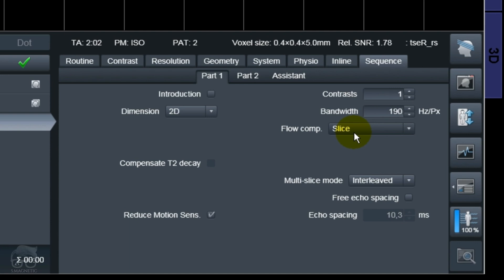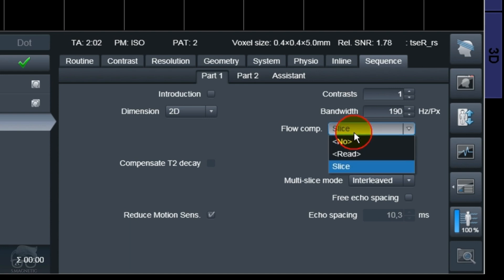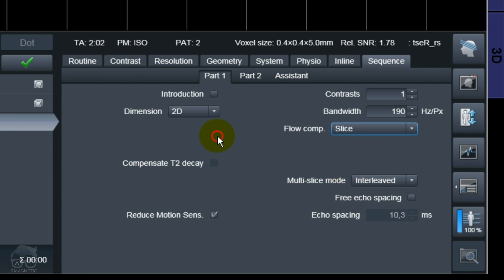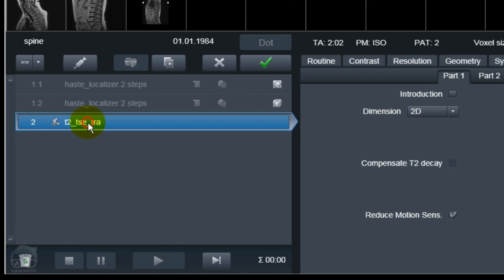Let's go here to flow compensation. You can find it right there — you have the options: null, read, or slice. We're going to use slice because it's the through-plane direction. I'm just going to rename this one so it will be easier for us to compare.